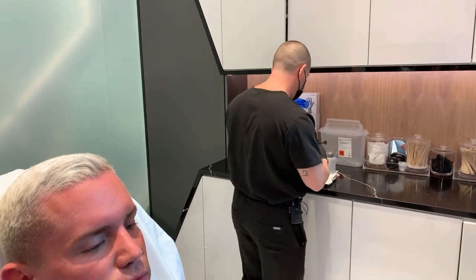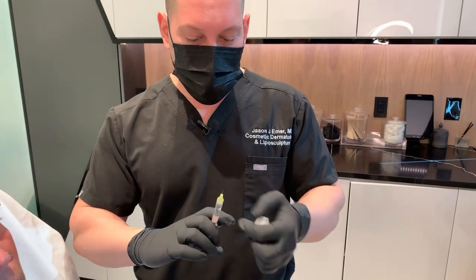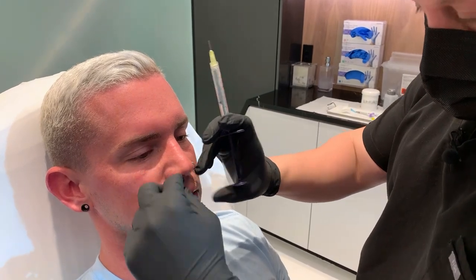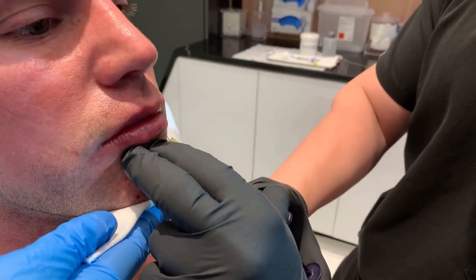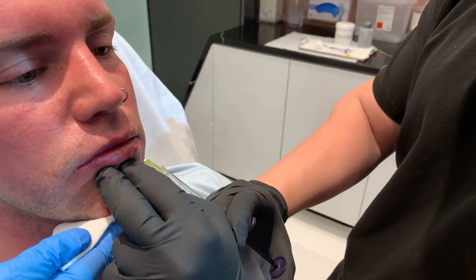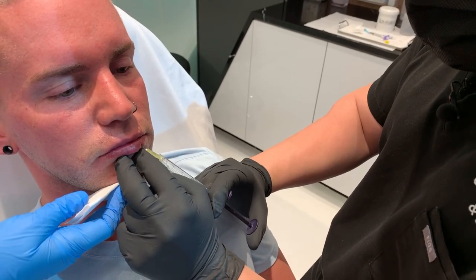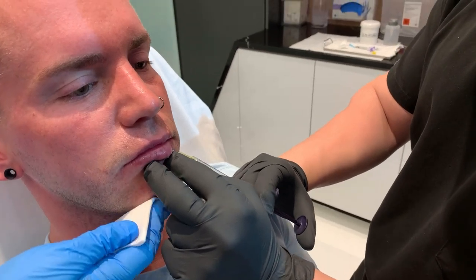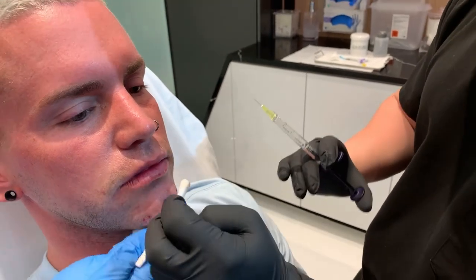So we're gonna switch over to a product that's a little more mobile, a little softer in look, and it's gonna give us a little more sort of shaping for the lip, and that's called Kysse. And so we're gonna just identify the areas we wanna go. We're gonna do some pillar, just gonna do very small amounts at a time. I'm gonna go nice and slow because the lip always hurts. He's had issues in the past with lips causing lumps and bumps, so we're gonna use a softer filler today that typically doesn't do that. And we're gonna balance it properly.